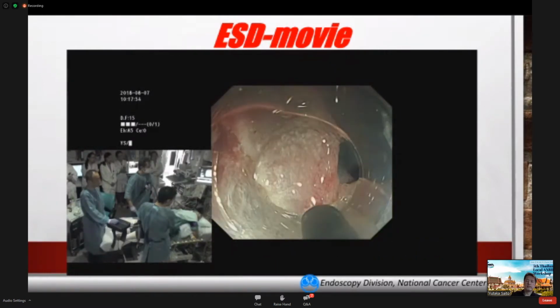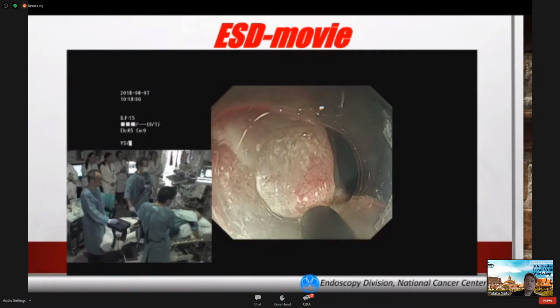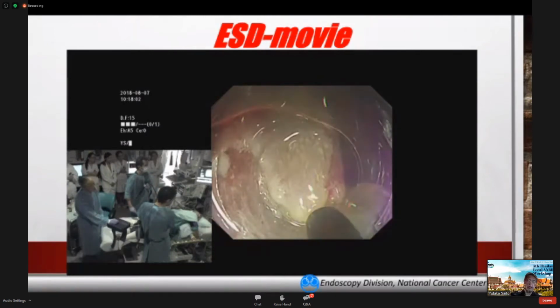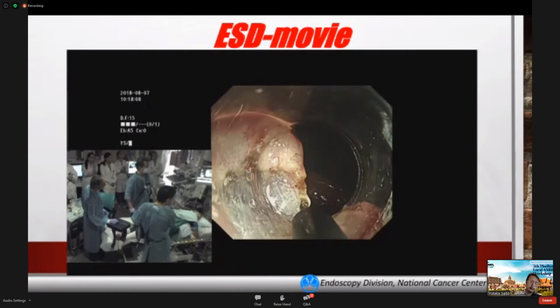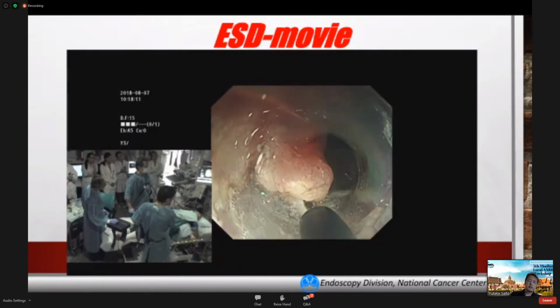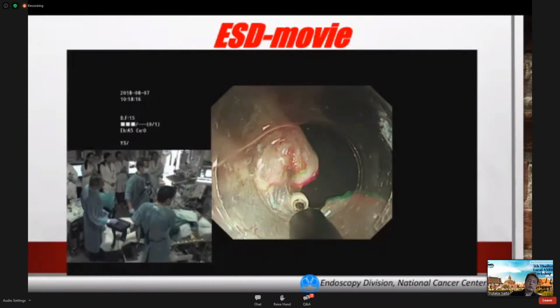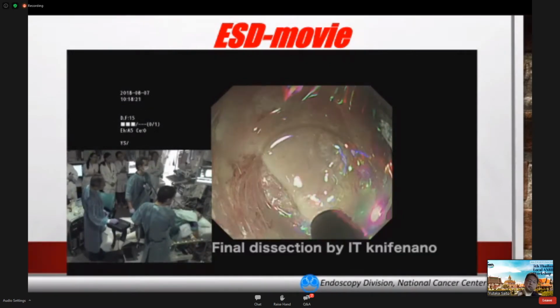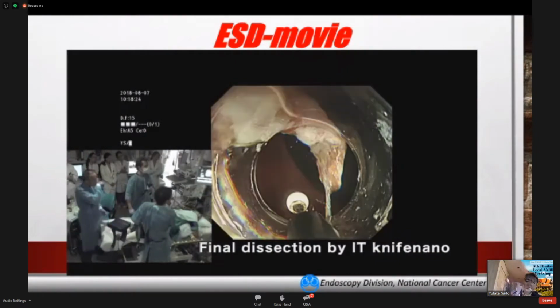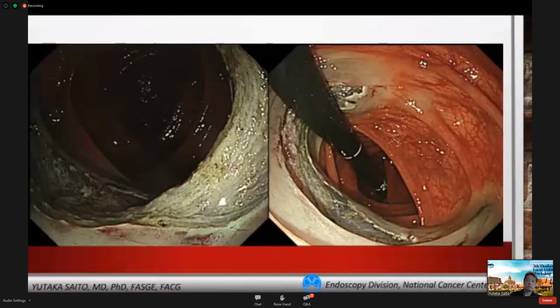Of course, as Dr. Supakij mentioned from the endoscopic finding, if during the submucosal dissection we encounter deep submucosal invasion or severe fibrosis, with no space between the muscle layer and the submucosal layer, we should stop the ESD procedure. But fortunately, the en bloc dissection was completed without any complications.